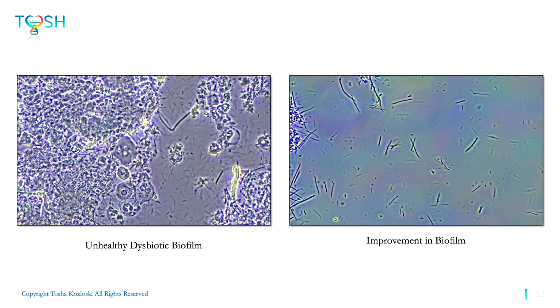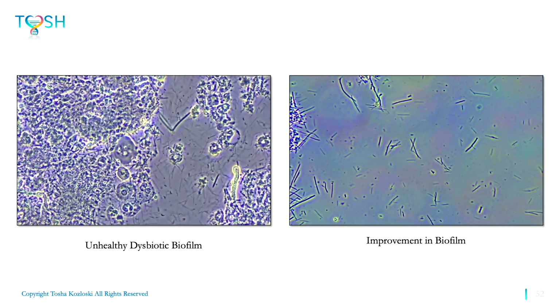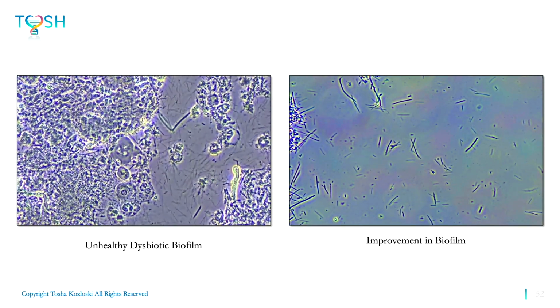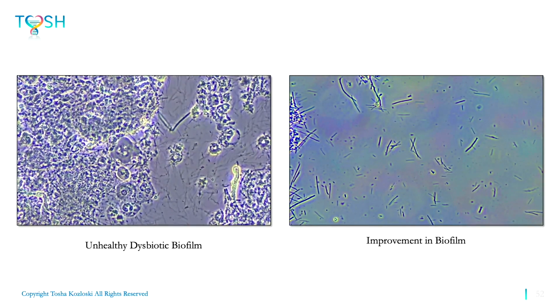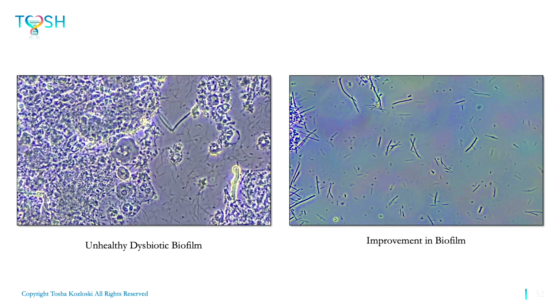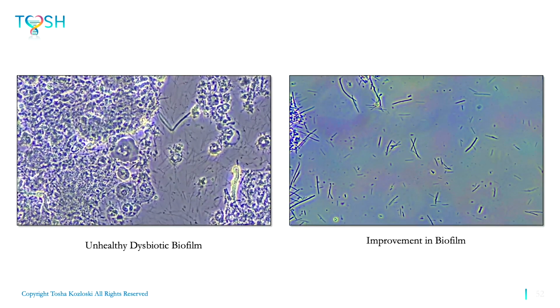So you may not see complete eradication of the bacteria, but you do want to see decreased volume and decreased motility. Over here we can see a couple rods dancing with each other. So her after is not perfect, but clearly better. Even to an untrained eye like our patients, they can see, hey, I've got a lot less squirmy, wormy stuff going on there, so I'm headed in the right direction.